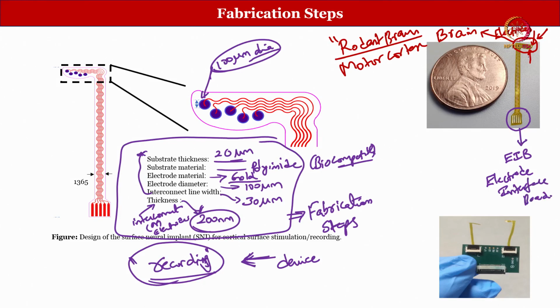You can see that here. Now look at this figure, let us say this is figure number 2. You have these electrodes and you see this connector. This is called an FPC connector, and this is also an FPC connector. This is a 5 pin FPC, and this I think is a 20 pin FPC, so you can accommodate 20 pins. Here we have 2 microelectrode arrays, or neural implants, an array of electrodes.